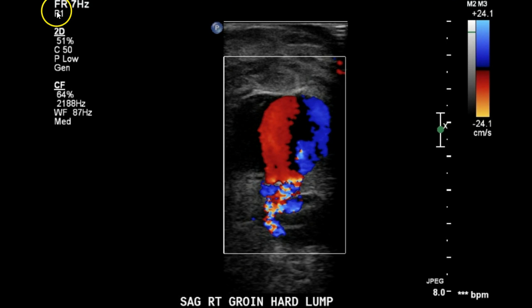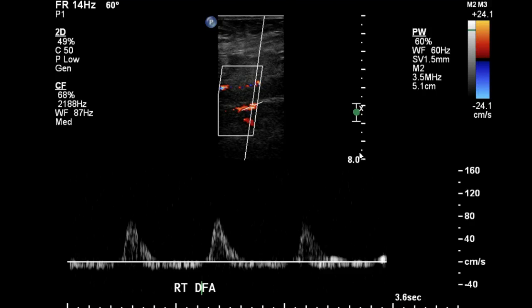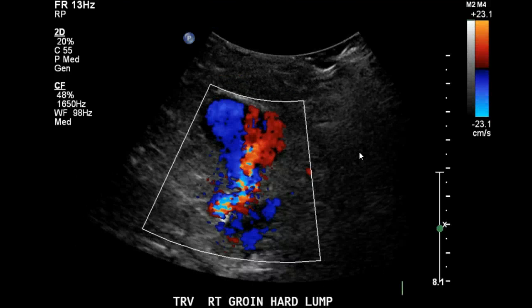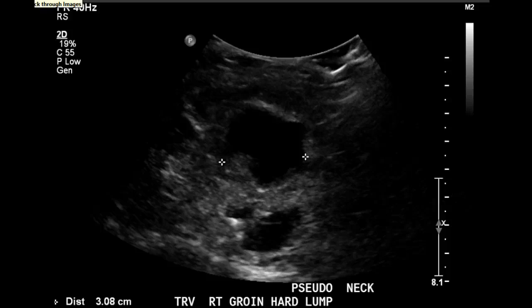Here's the classic yin-yang — or as one of our doctors likes to refer to it, the Pepsi-Cola sign. That's a classic representation of a pseudoaneurysm you'll see. With more measurements, you want to make sure you get as many pictures as you can to show a clear representation of the pseudoaneurysm. Obviously, there will be more studies performed on this person until this issue is resolved.